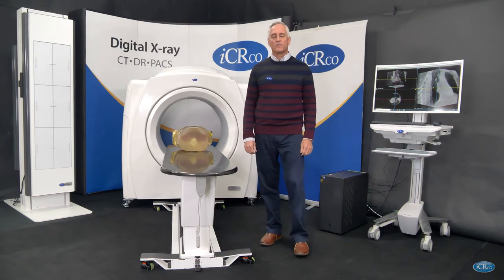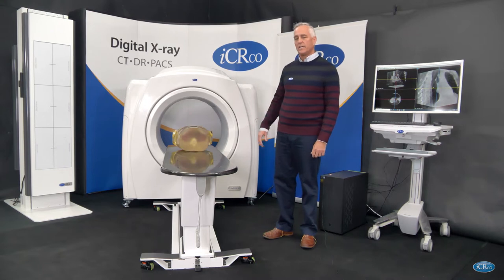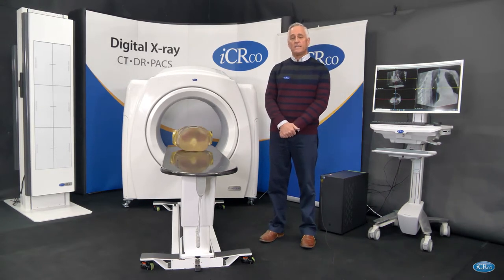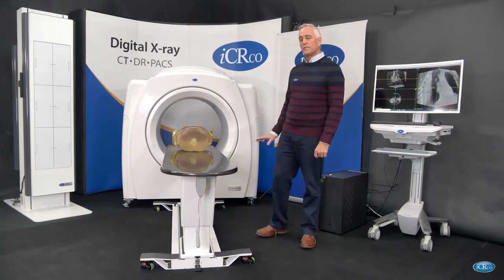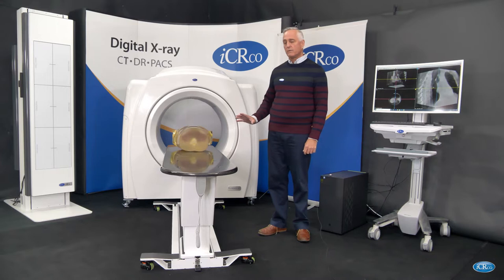Hello and welcome to ICRCO's introductory video for the Claris XT CT machine. This is a revolutionary new type of CT with ultra high resolution and ultra low dose. It's very well suited for veterinary applications but also for human applications.